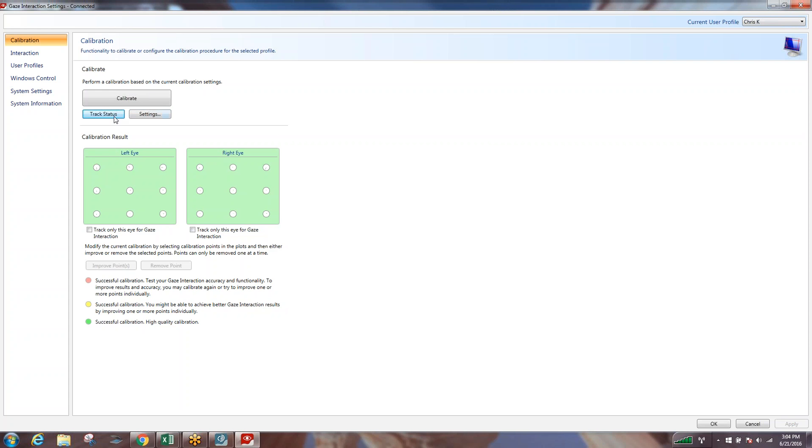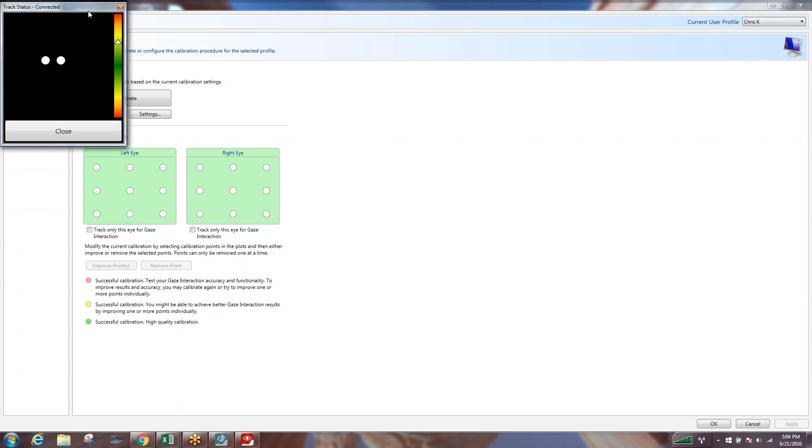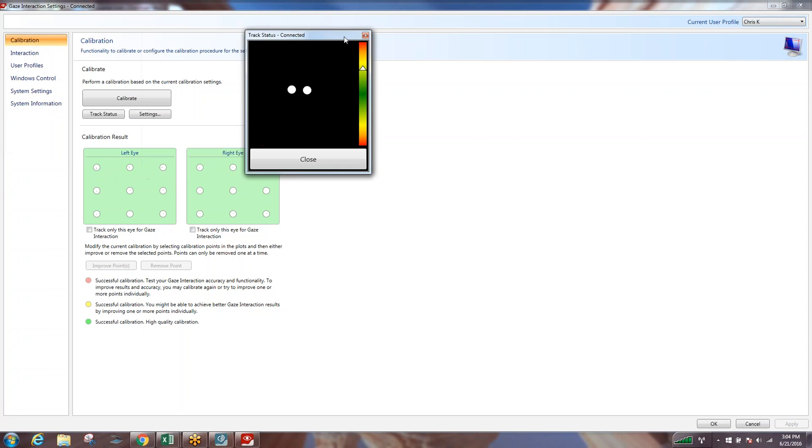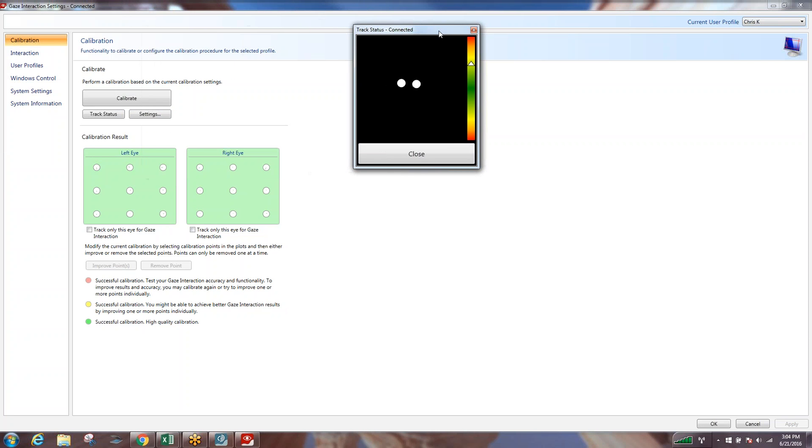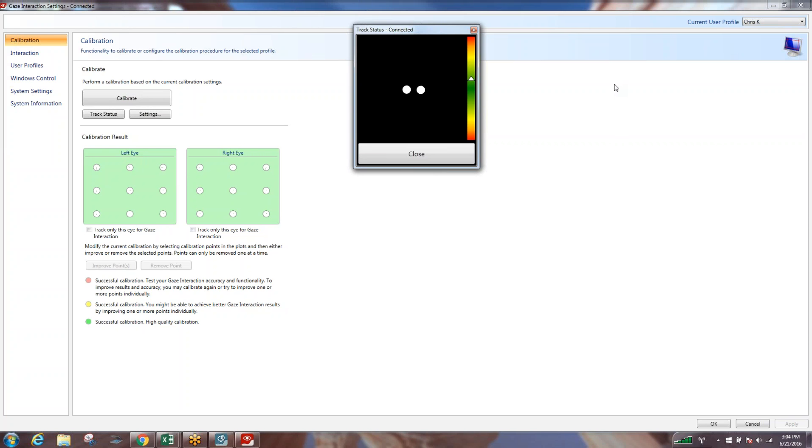What we want to do is pull up that track status box and as you can see my unit is now picking up my eyes, both pretty well solid white circles. What we want to do is try and get that representation of my eyes to be in the center of the black box, as close to the center as we can both vertically and horizontally, and we want those circles to be as solid white as possible. That means the cameras and the illuminators are picking everything up properly.